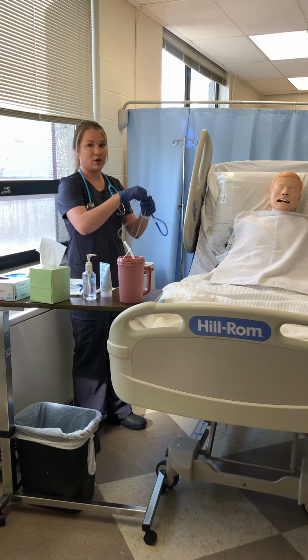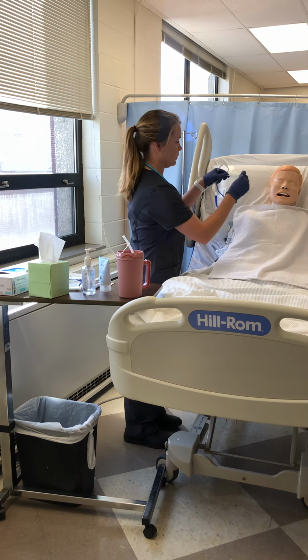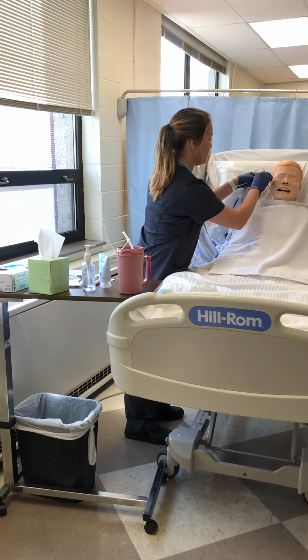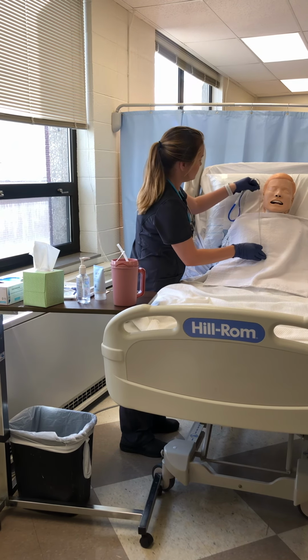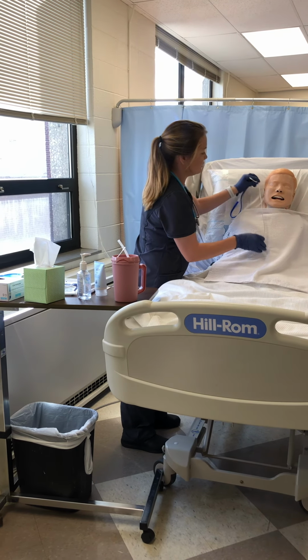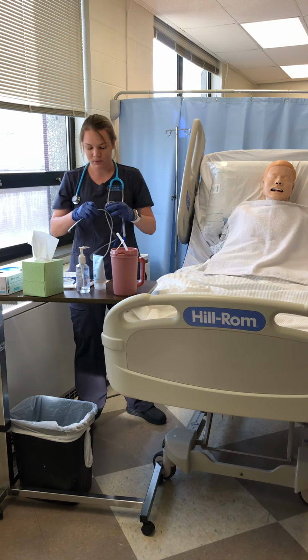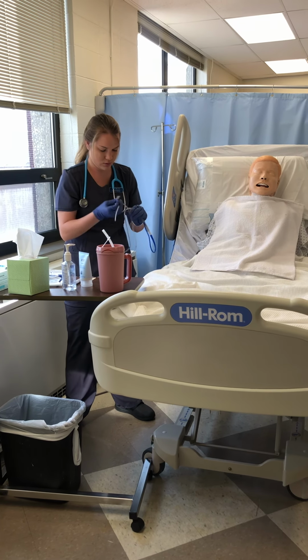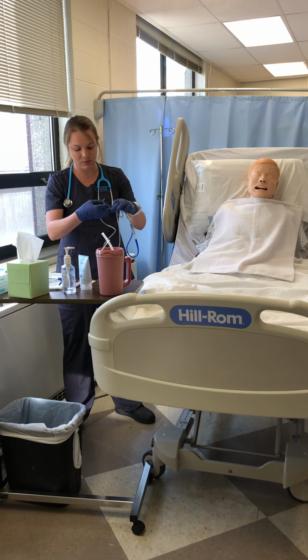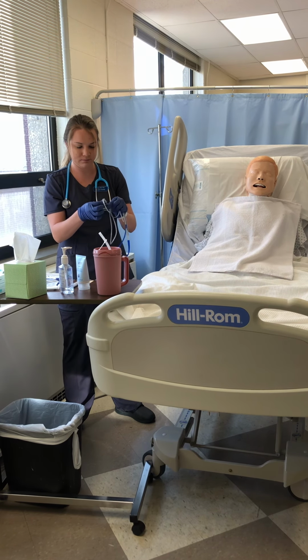And I'm going to measure how far to insert the tube. So from the nose to the ear, and then the ear down to the xiphoid process, which is right at 55 centimeters. So I'm going to mark that with my tape at 55 centimeters so I know how far to insert it.